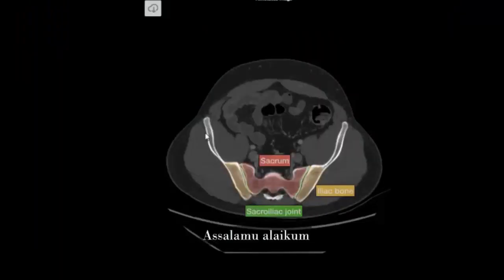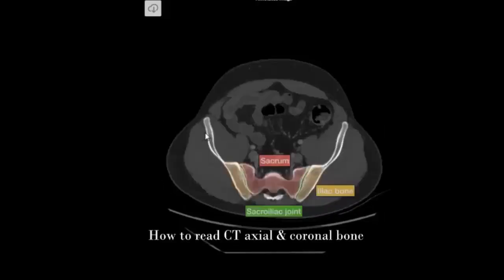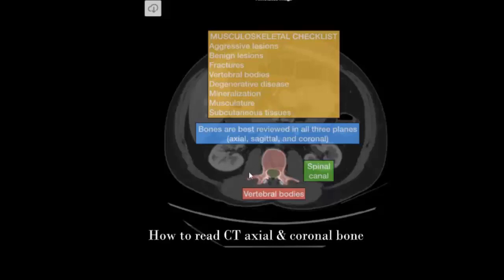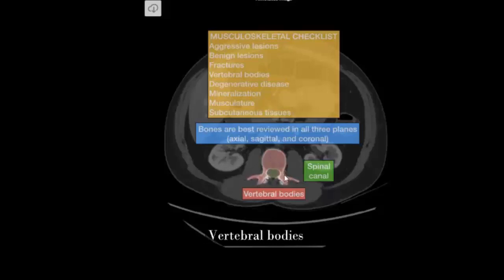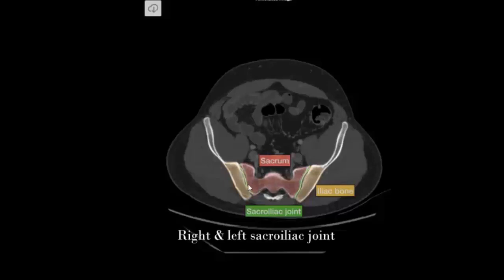Asalaamu Alaikum Warahmatullahi. Today I will share how to read a CT scan of axial and coronal bone. Vertebral bodies, spinal cord, sacrum, right and left sacroiliac joint.